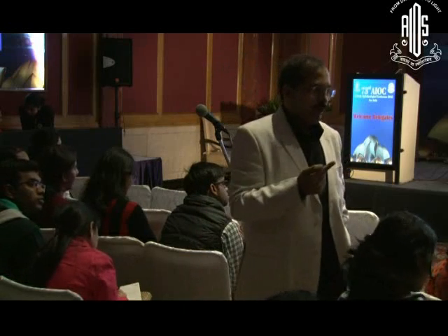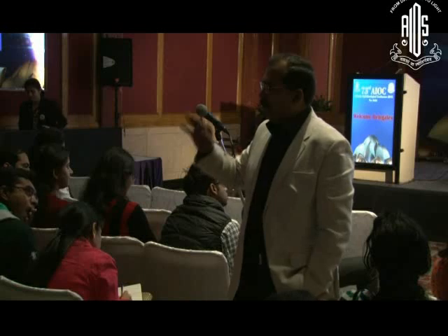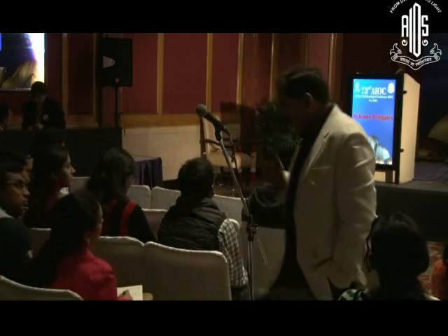If you can't do LASIK, turn to PRK. If you can't do PRK, turn to phakic IOLs. You can implant a lens between the iris and the lens, called phakic IOLs, and that is theoretically the best way to correct a refractive error. In LASIK you are basically messing up the cornea, with a lot of induced higher order aberrations, and the patient will have a very bad quality of vision. But with ICL or phakic IOLs, you will have excellent quality because the cornea is not touched. So phakic IOLs will be the way we go ahead in most cases in future.